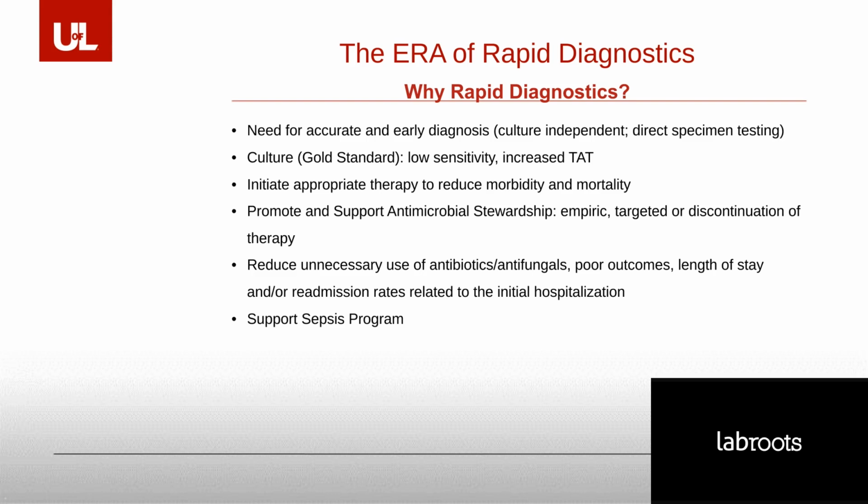Culture remains as the gold standard, of course, but it has low sensitivity. And it also increases our turnaround time to generate final results. We need to influence through antimicrobial stewardship, the initiation of appropriate therapy, specifically targeted therapy, in our efforts to reduce morbidity and mortality.